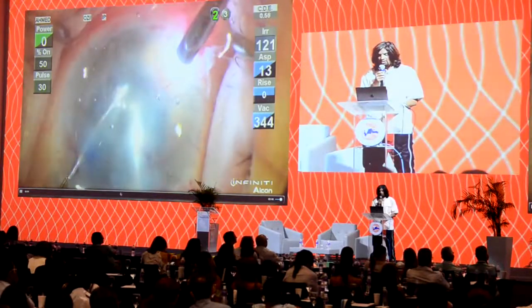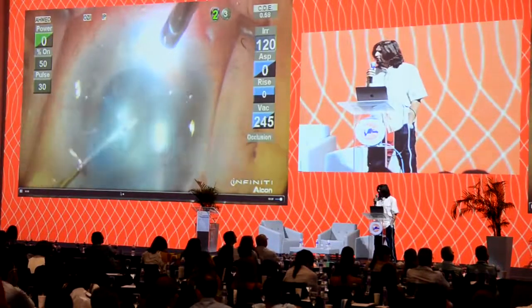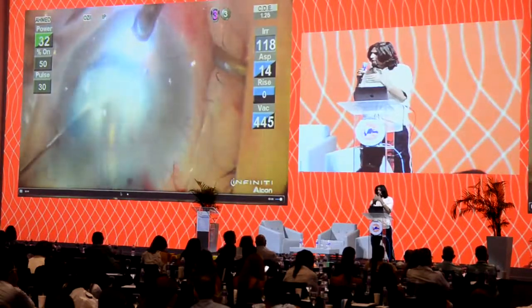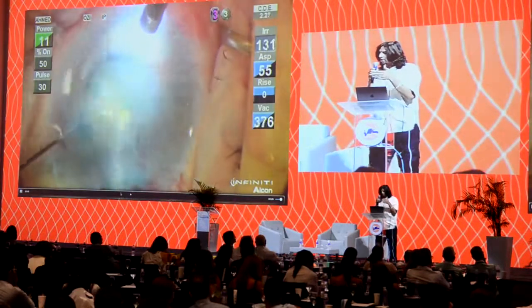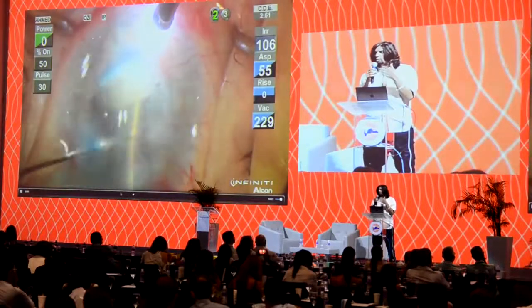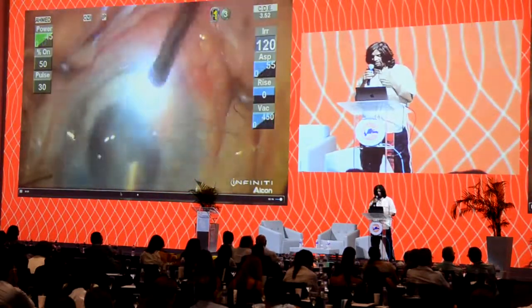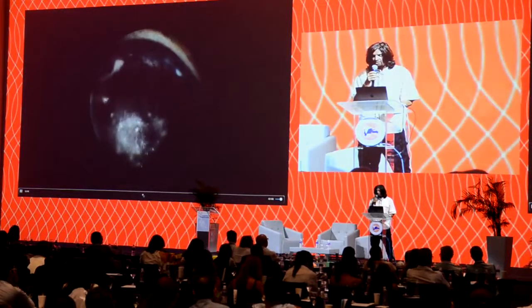And then we'll continue our phaco, which, and I don't mean to boast, but when you really are comfortable with phaco, you don't need to see what you're doing. I know this sounds kind of funny, but you can tell what's going to happen when your hands go in a certain position and you chop and do certain things, and you have confidence in your fluidics. I've never operated blindfolded, but I'll tell you how we train our fellows shortly. But this is where we use our sense of what to expect. Every time you touch a tissue, you know how it's going to react, and you know that because of your experience and because of your observational skills as well. Side illumination helps, and there we have a plaque.